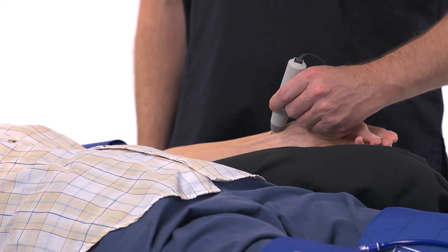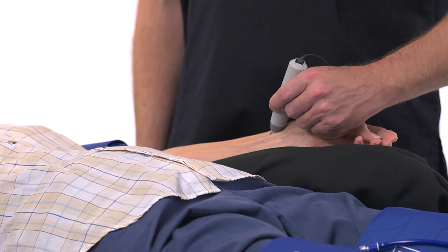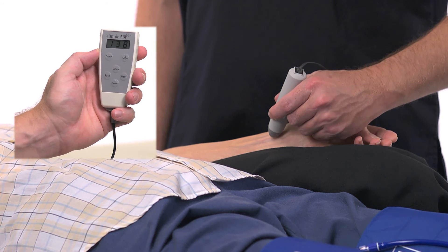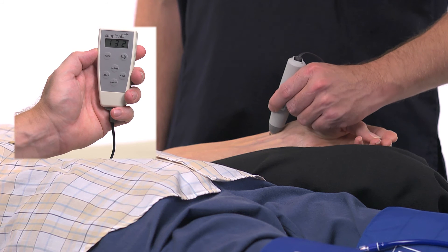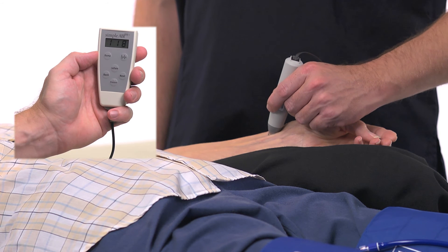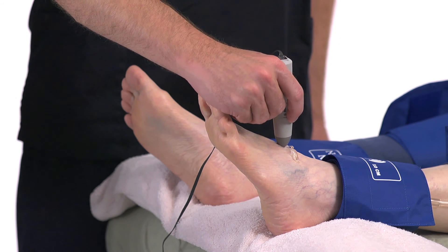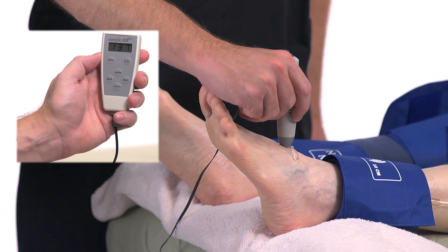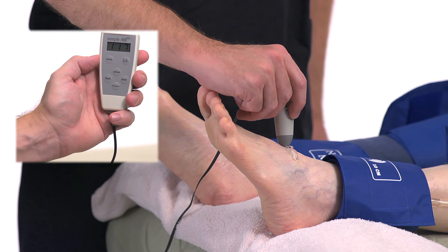Repeat the sequence you just completed on the right side for the patient's left side. Find a good Doppler signal at the left radial or brachial artery. Press and hold Inflate on the CuffLink remote until you no longer hear the Doppler signal, then continue for an additional 20 millimeters. Release the Inflate button and the cuff will automatically start to slowly deflate. When you hear the Doppler signal return, press the Pressure button and it will be entered in the left brachial field. Press Next to move to the left DP field. At the left DP, find a good Doppler signal, press and hold Inflate until blood flow is occluded, then release the Inflate button and press Pressure when blood flow returns. The left DP pressure will be entered in the left DP field.